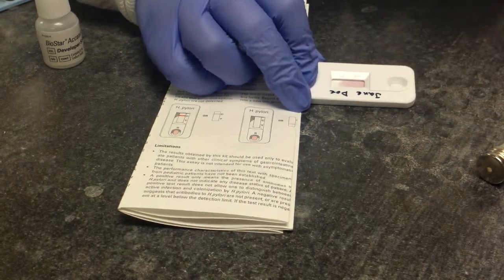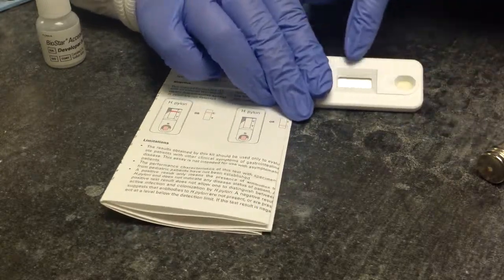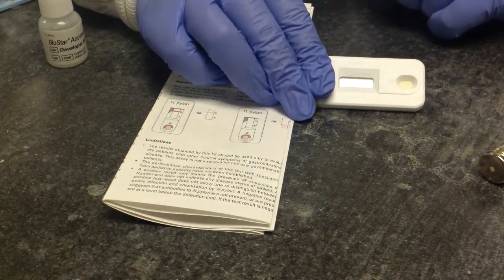And I actually have a positive test cartridge here to show you. So the control line is there, which means our test is valid. And the test line is there, which means that our test is positive.